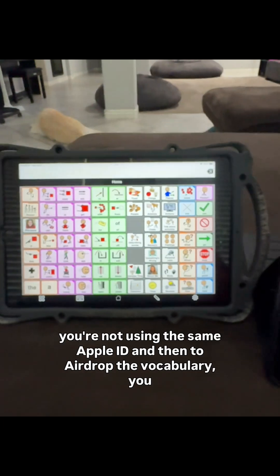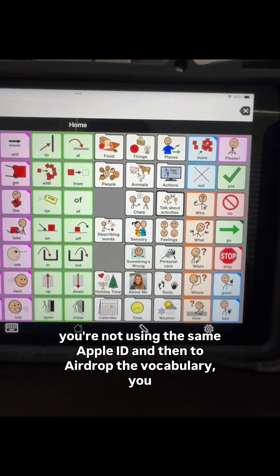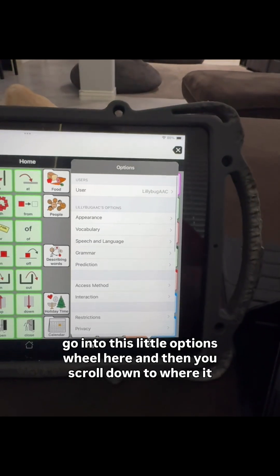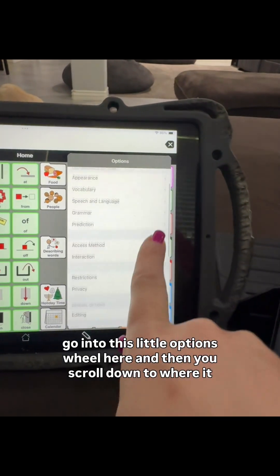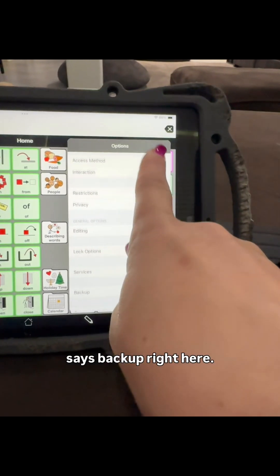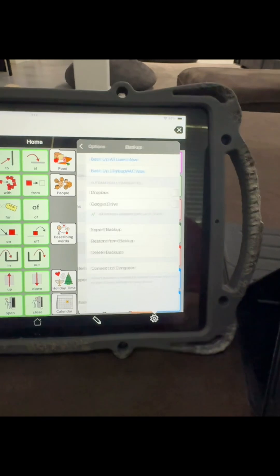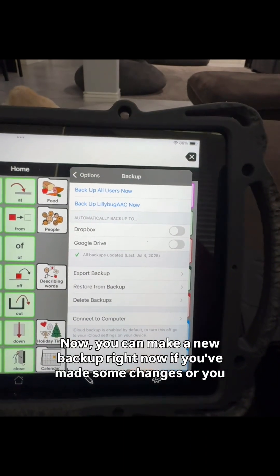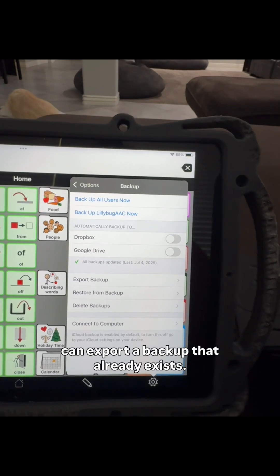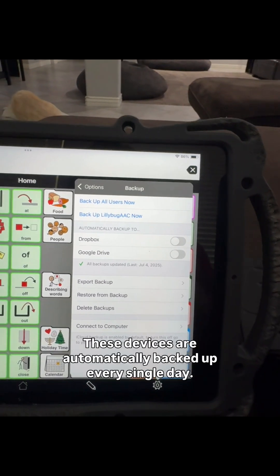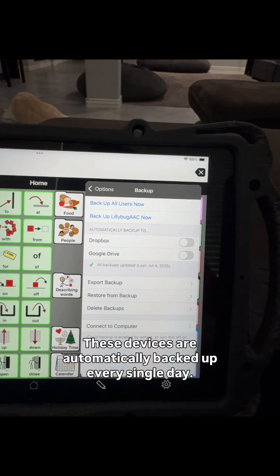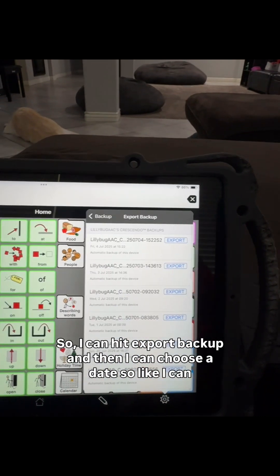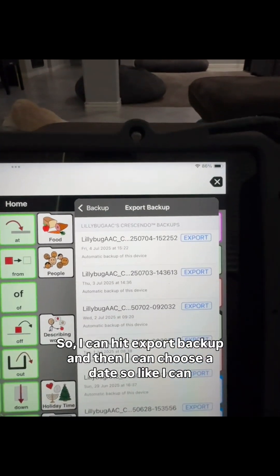To AirDrop the vocabulary, you go into this little options wheel here, and then you scroll down to where it says Backup right here. You can make a new backup right now if you've made some changes, or you can export a backup that already exists. These devices are automatically backed up every single day.